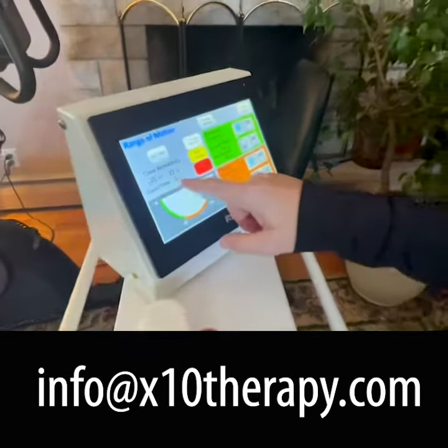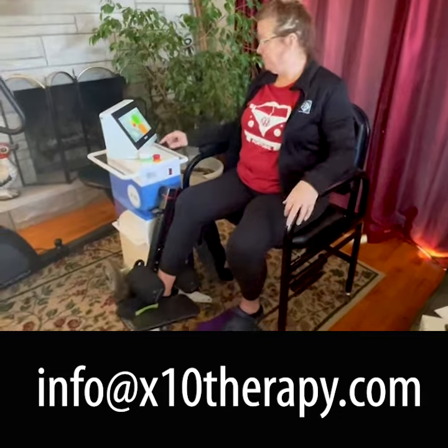You hold on a dwell time for three seconds — I have that set for me, I did that on purpose. And then you have flexion. I started at about 85 degrees, and now I'm at 120, so it really, really works. You just sit here and let it move you. It's pretty cool.